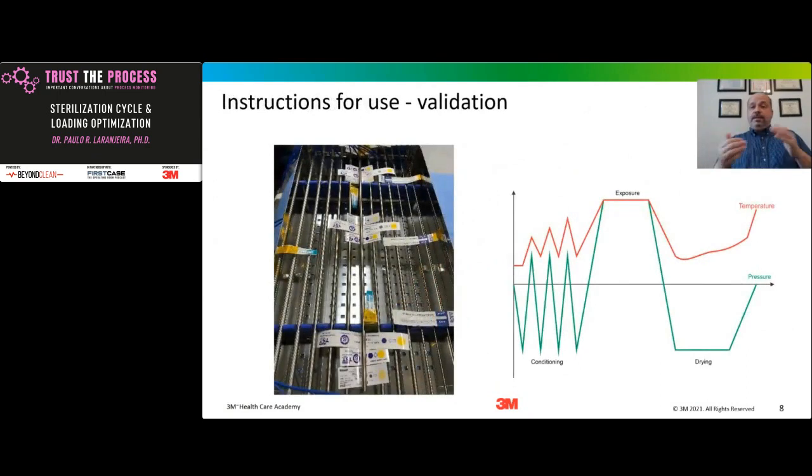And what I just explained to you was what drove my initial research, my willingness and desire to find answers. Why do we have so much condensate with non-metallic, with metallic, lumen devices, non-lumen devices?